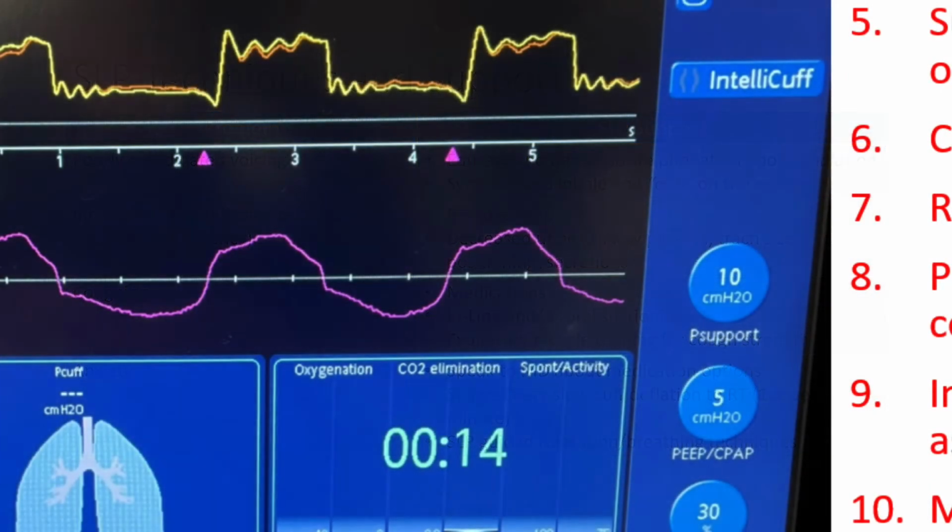But anyway, looking at vent adjustments for this patient, Thomas, what do you think? So similar vent settings. The previous example had a pressure support of 10/10 and 40%. This is 10/5 and 30%. So this patient's oxygenating better than the previous example because they're using less PEEP and less FiO2. They're both using the same level of pressure support.